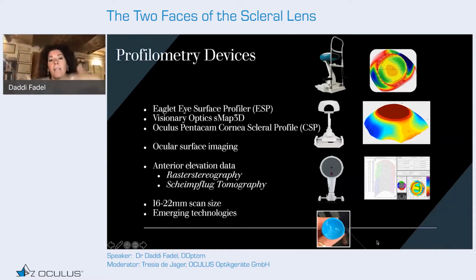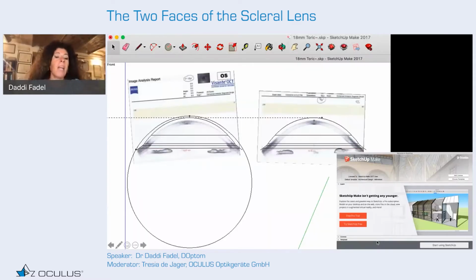Clinicians must have at least one of these techniques to provide optimized vision and to achieve fitting success and comfort when wearing scleral lenses for their patient. So as I stated before, I customize all my scleral lenses.